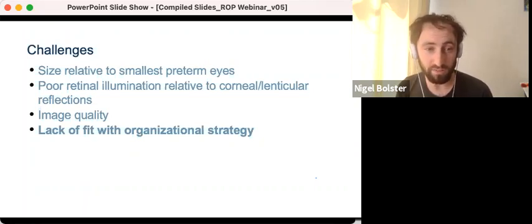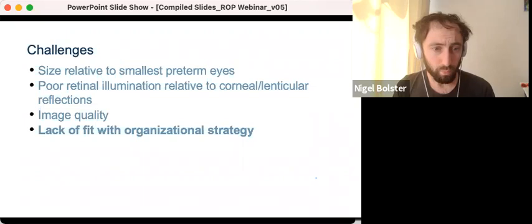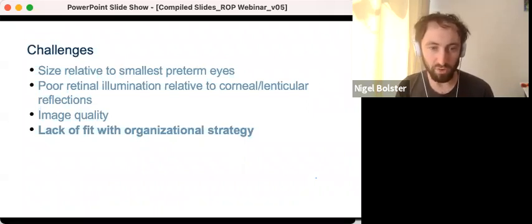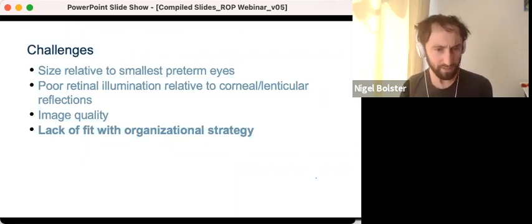However, we also found that reflections from the crystalline lens caused a visible artifact in our image, and that's despite attempts at filtering these in hardware. Improved filtering, including software filtering, is therefore something that ought to be looked into next. We were also very conservative when it came to setting the safe range of possible illuminations. What we actually found was that the illumination was fairly dark, particularly in darker retinas. And so what we suggest looking for in subsequent design iterations is if that illumination level can be safely increased.